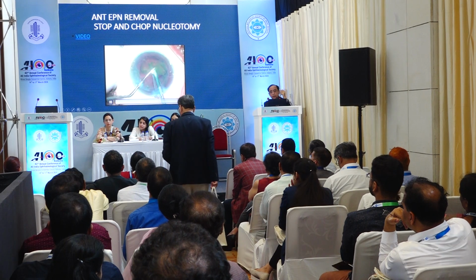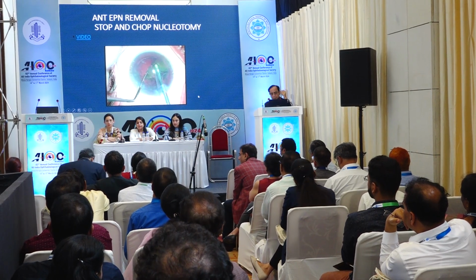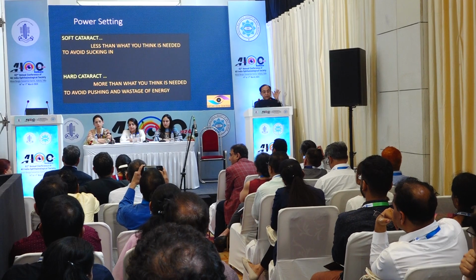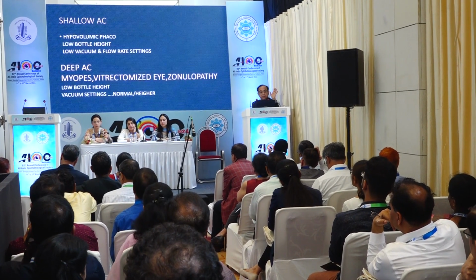So you can see that this nucleus falls back nicely without any problem. So power setting in a softer cataract is less than what you think is needed, to avoid sucking in, and in a harder cataract more than what you think is needed.